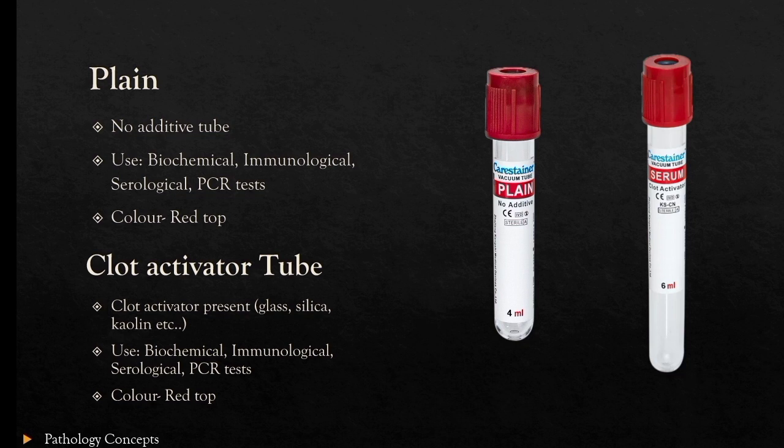Clot activated tube. It is the same as a plain tube, but it contains a clot activator. Clot activator is added to accelerate clotting. Clot activator may be glass, silica or kaolin, etc.